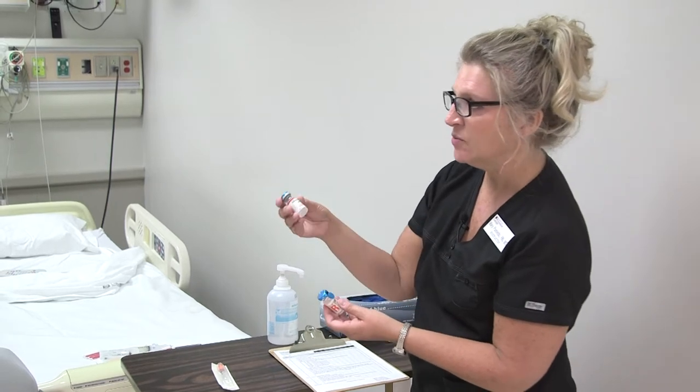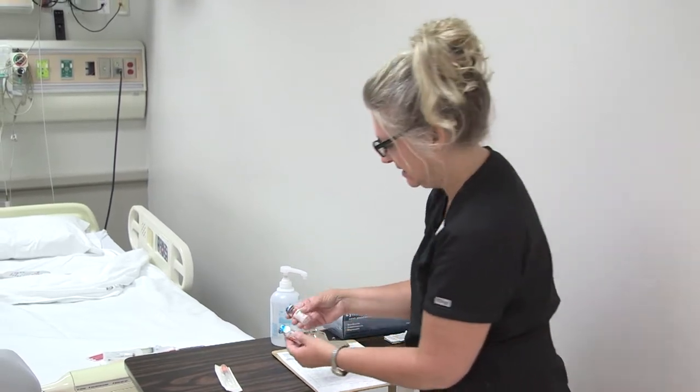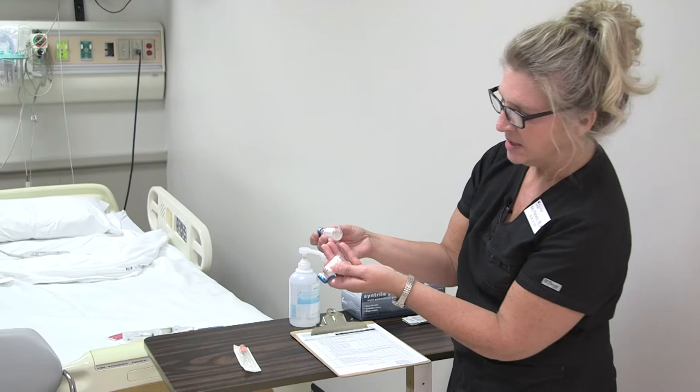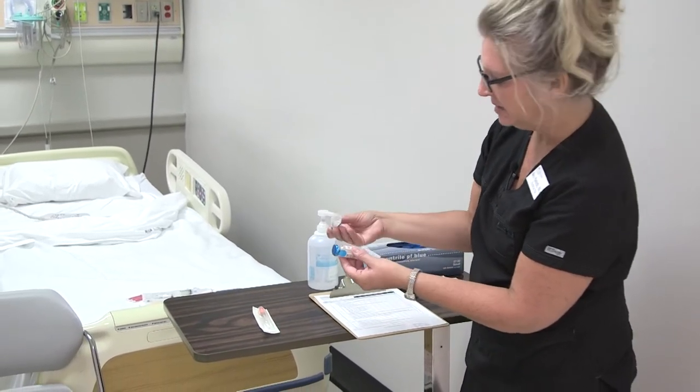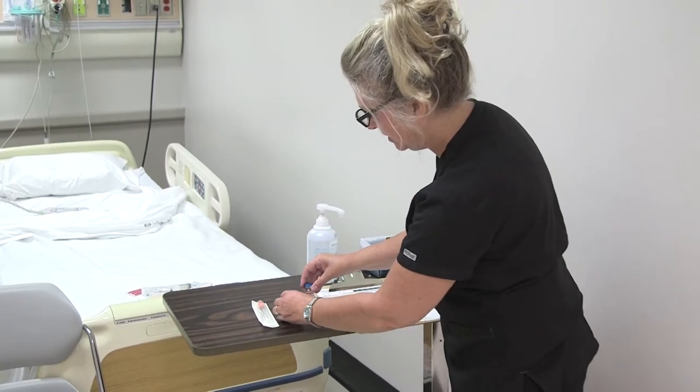One is short-acting and one is intermediate-acting. If you have both of them, you just want to inspect the vials to make sure everything looks good — that you don't see any clumping or particles. Both of these look really good.